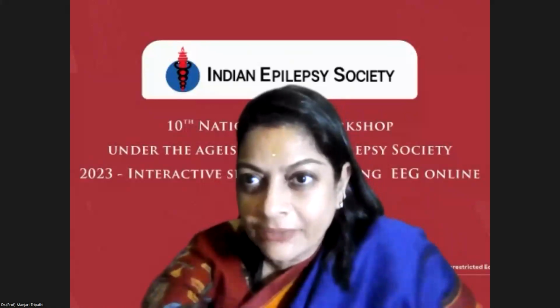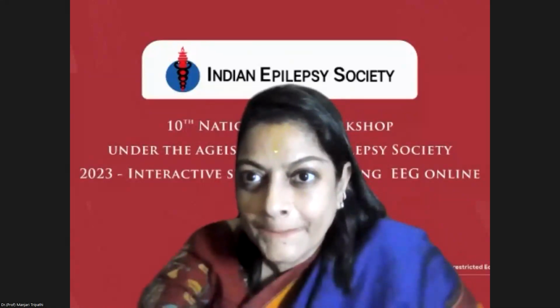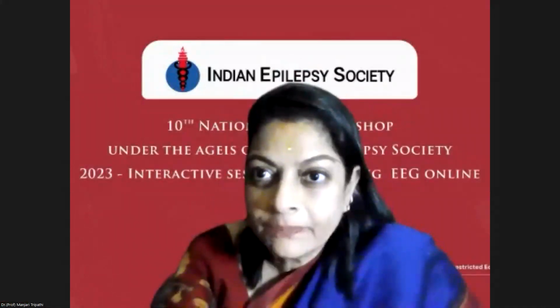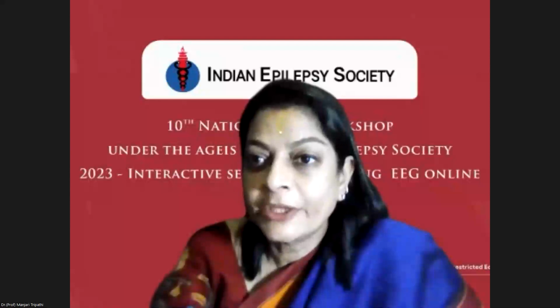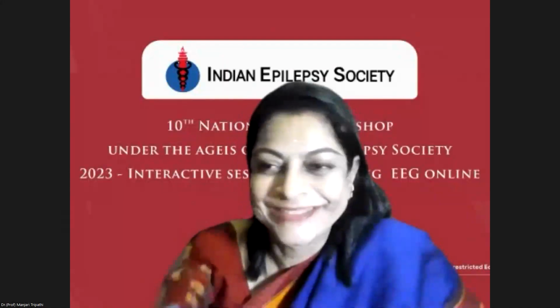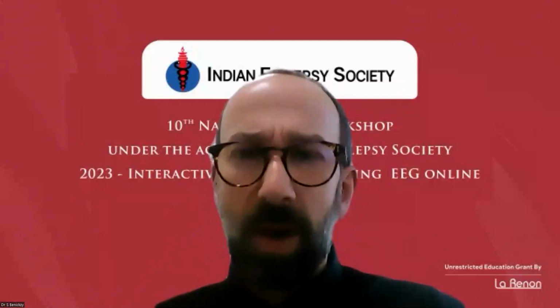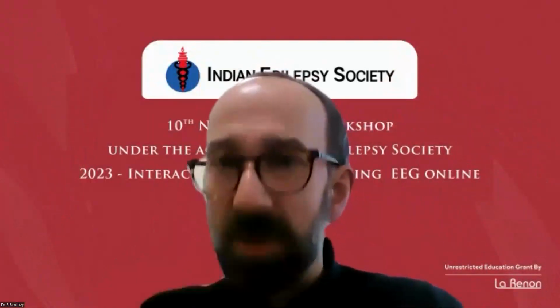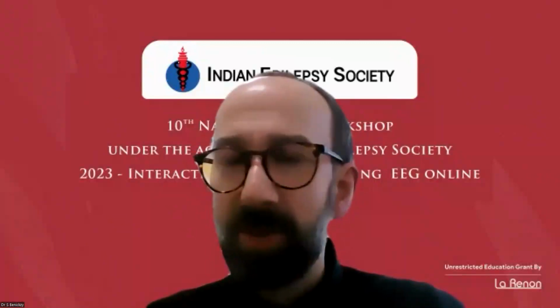There are some more questions. Can we continue to take them? Yeah, please. Sure. There's a question by Dr. Triveni. Can you explain spatiotemporal evolution? Yes. This is like the fingerprint of the ictal EEG pattern. I always teach my students that an ictal pattern is not a dead pattern. It's not monomorphic. It's not like a machine going on, but it has its own life.